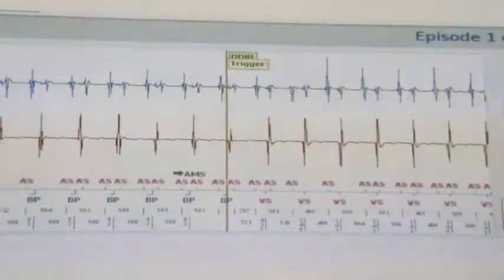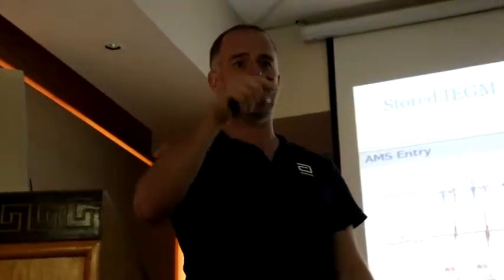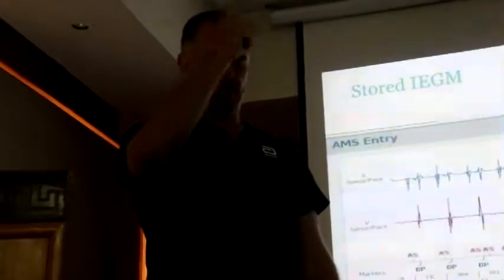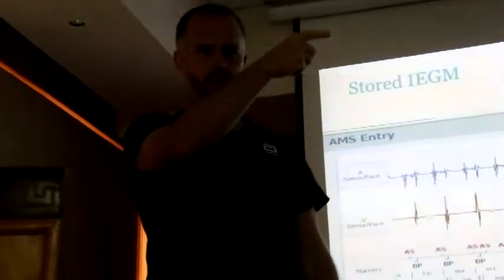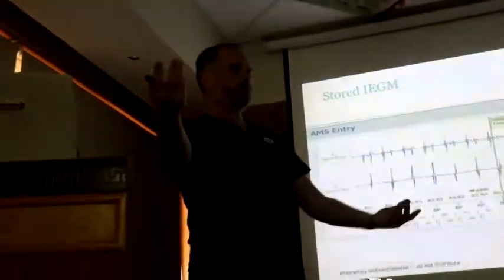So you'd have to be really insensitive on your atrial channel, and then if you went into real AF, with all the change of cycles, you'd miss loads, and you probably wouldn't mode switch. So really rare. There's only one time, and it happened 6 weeks ago, where I've had to change the decay delay threshold start on an atrial lead, and it was for far-field P-wave oversensing. So the atrial lead sensed the right atrial signal, and then it sensed the left atrial signal. Wow. Yeah, it's quite cool.